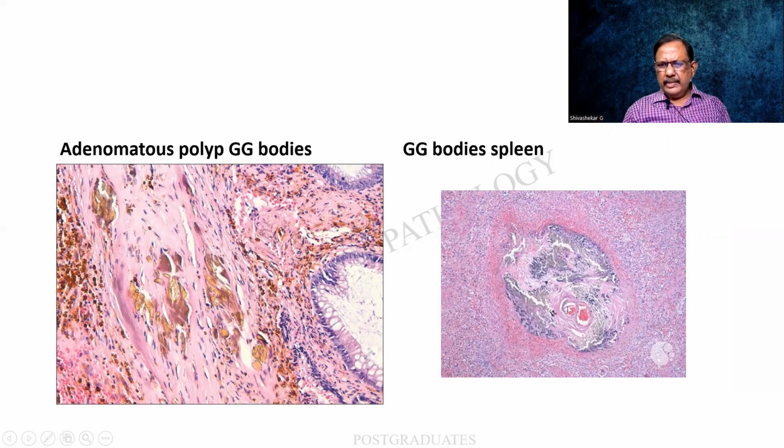This incidentally is the spleen, which I can identify by means of the eccentric arteriole, and this is the splenic trabeculum. And I find that exterior to it, usually the arteriole, it is called an eccentric arteriole because now it is not in the center. And I'm finding the deposits of iron and calcium. The iron takes up a blue color.